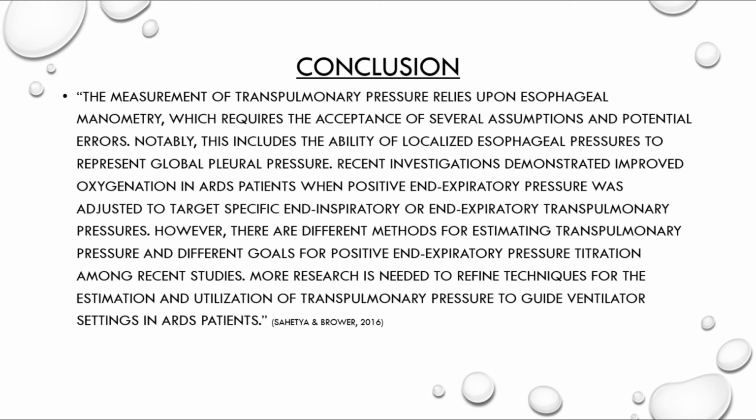Patient positioning is going to play a factor. Recent investigations demonstrate improved oxygenation in ARDS patients when the PEEP was adjusted, and there are different methods for estimating transpulmonary pressures, and also we want to keep in mind what our goal is.